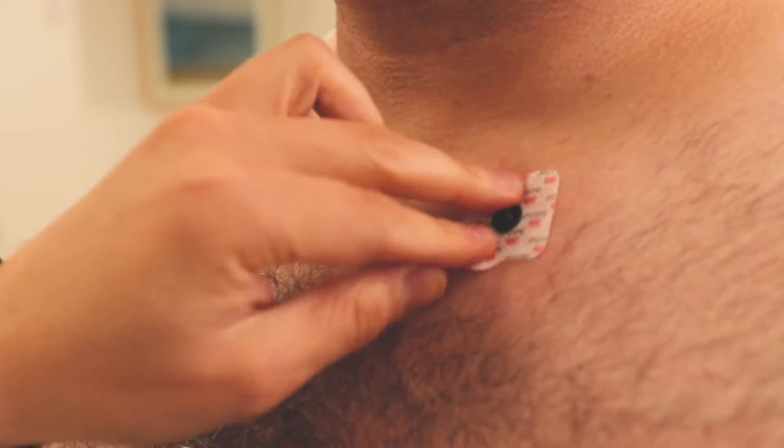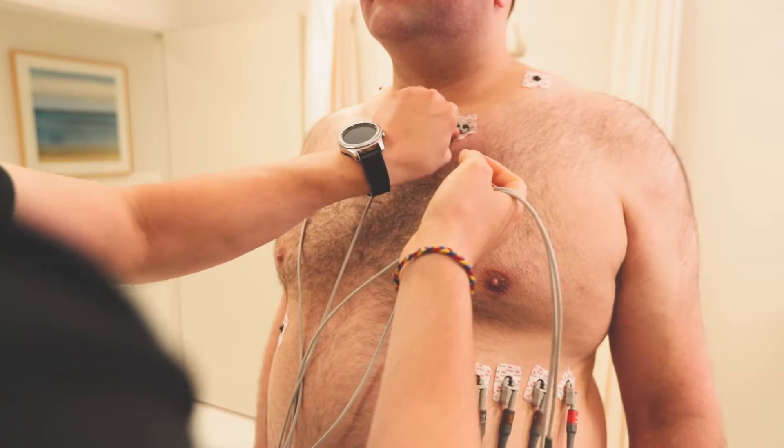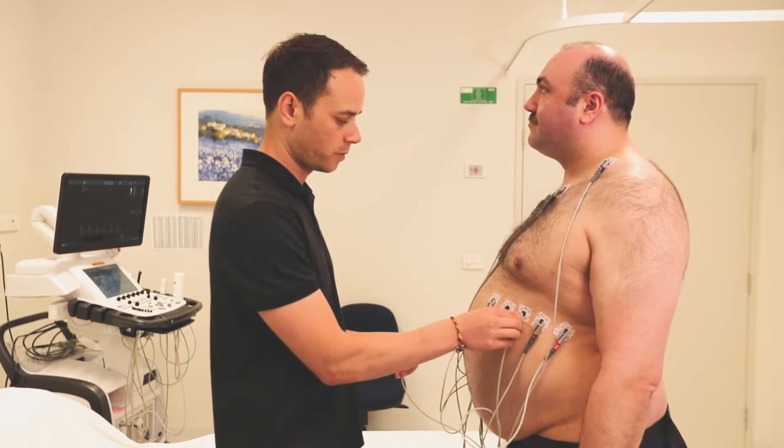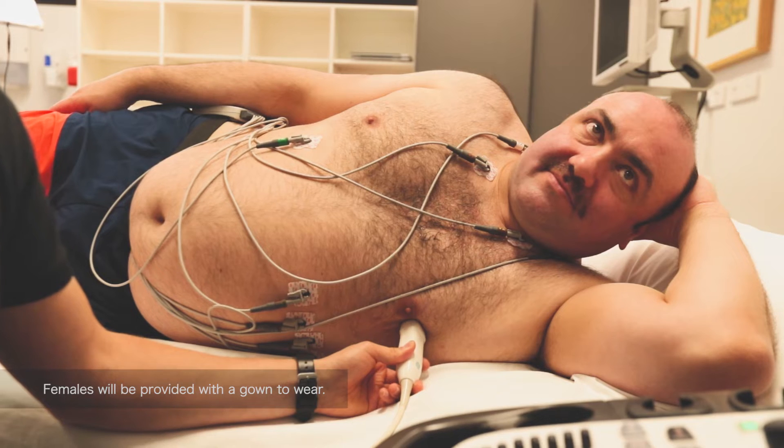When you are ready to begin, the sonographer will place sticky patches onto your chest and wrap a belt across your waist to attach electrodes, which will monitor the heart. Females will be provided a gown to wear.